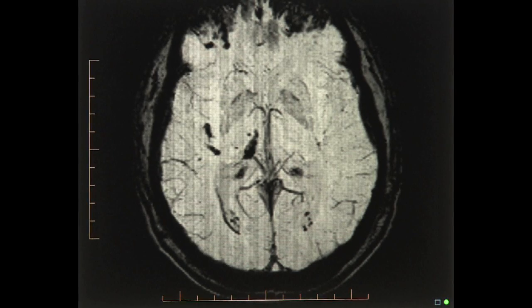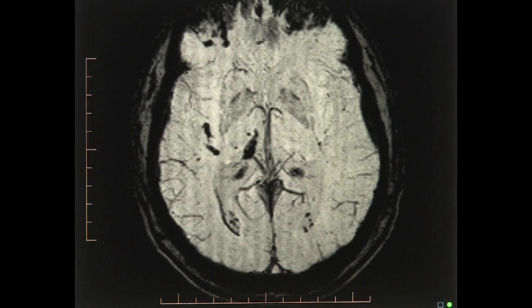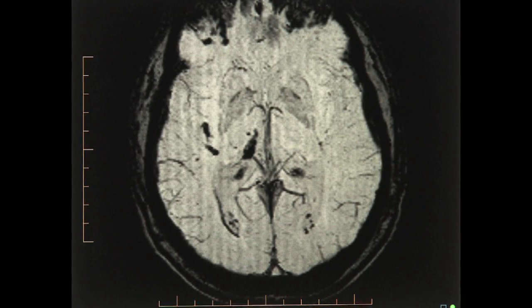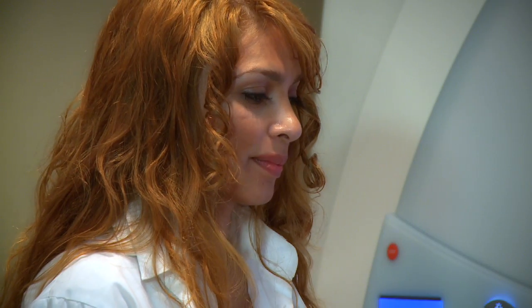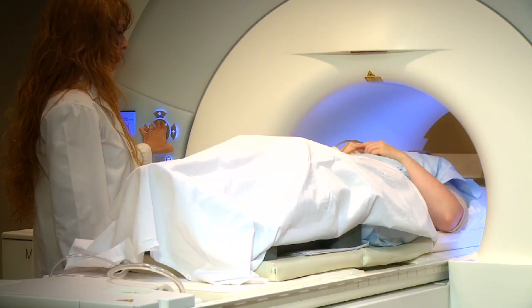SWI is sensitive for the identification of hemosiderin, which is the final breakdown product of blood. The process of breaking down blood to obtain hemosiderin takes a certain period of time — days to weeks — and therefore ideally SWI is not done in the first few days, but rather several weeks or months later.